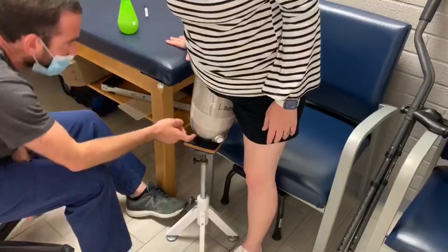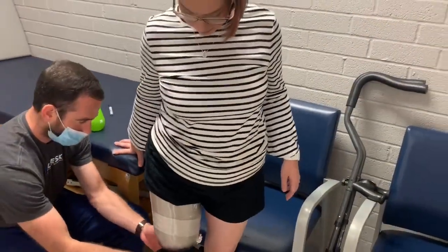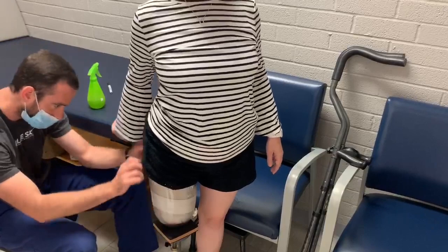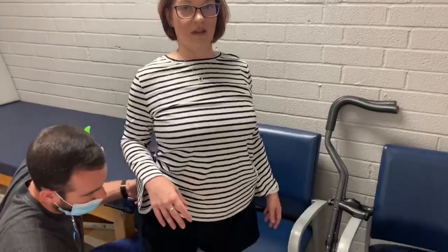And so yeah, we're still a little bit from the bottom, but I'm going to start checking some things that might tell me. If you can, just straighten your left foot just a smidge. It's tough because you're reaching behind yourself. I actually need to take a look right here. I'm going to feel for that butt bone again.